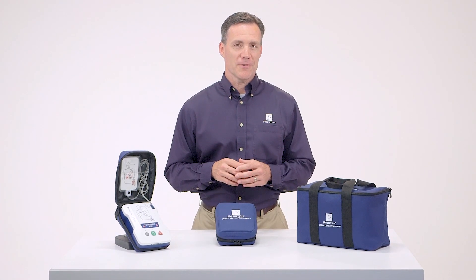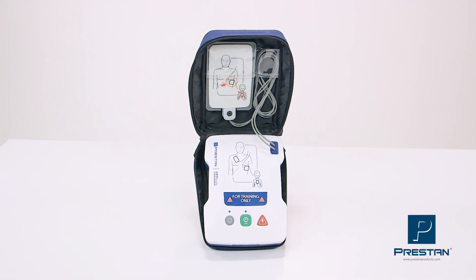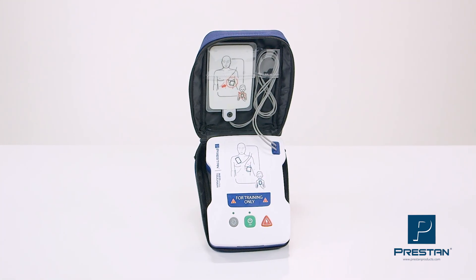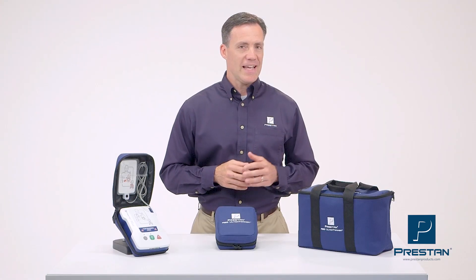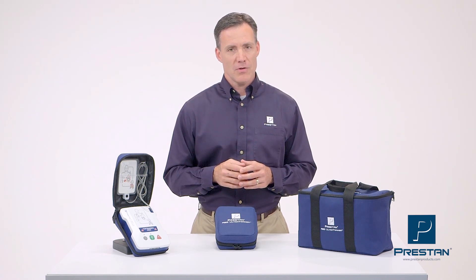As a CPR instructor, it is important to have reliable equipment — for example, an AED trainer. The low-end AED trainers are affordable, but the quality is poor and they're just not reliable.